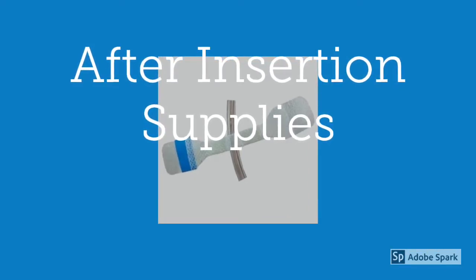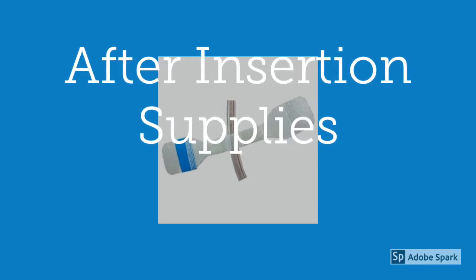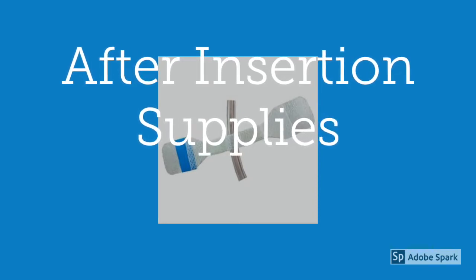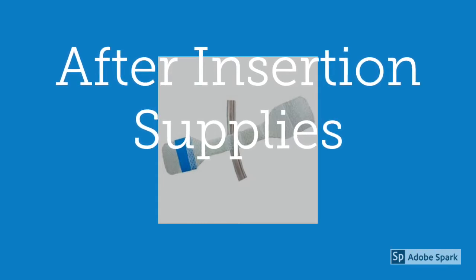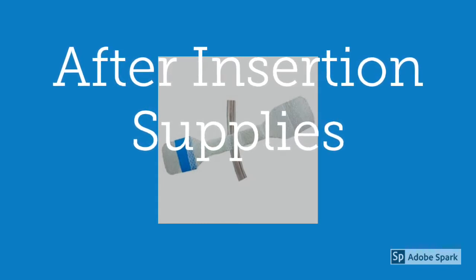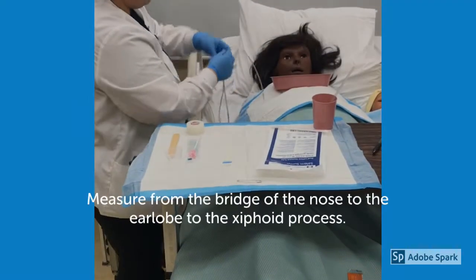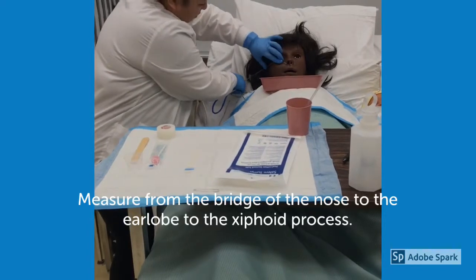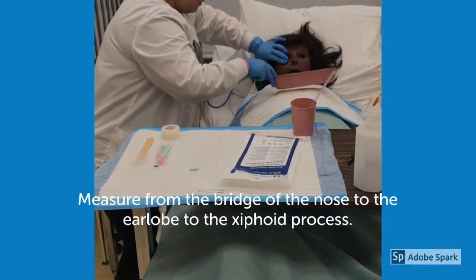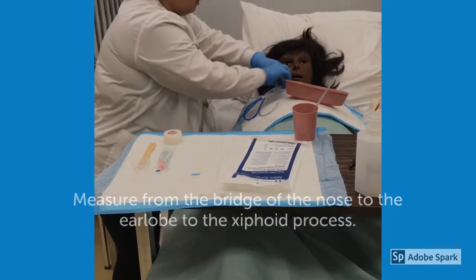Bet you thought we were done with supplies, huh? Almost. We need a few things for after the tube is in place. Make sure you have tape or an NG securing device, a safety pin, an irrigation tray with a piston syringe, medicine cup, marker, and pH strips. Prior to inserting the NG tube, we need to measure using the tube from the bridge of the nose to the earlobe and then to the xiphoid process, and mark with tape or note the measurement.